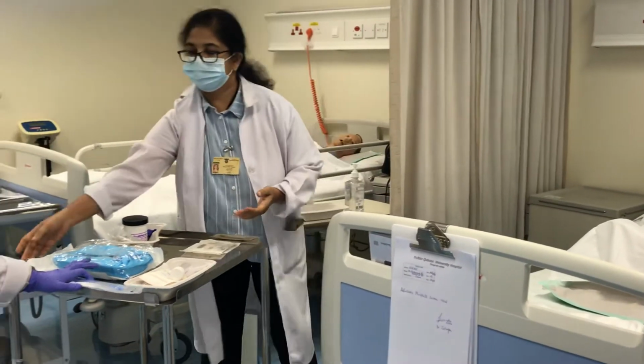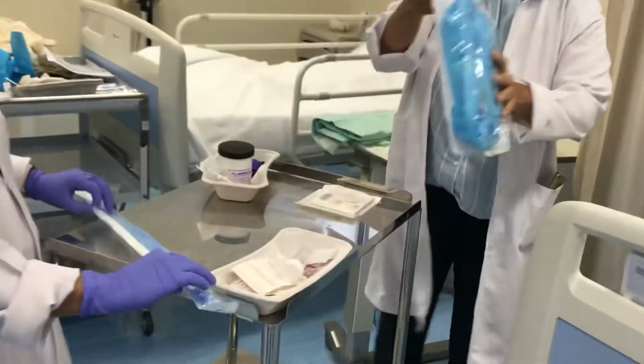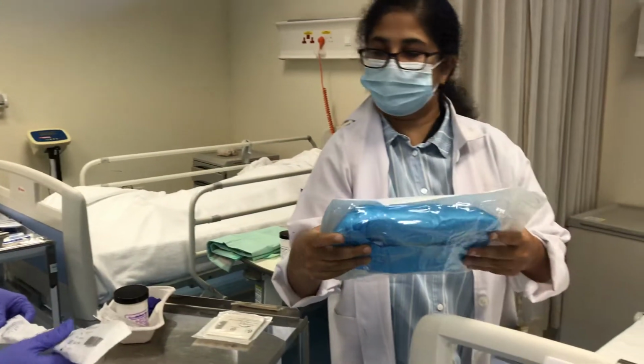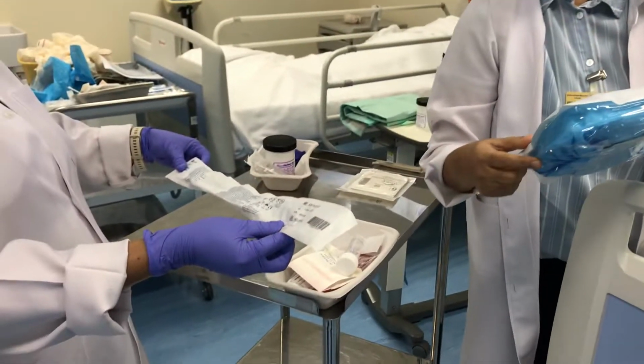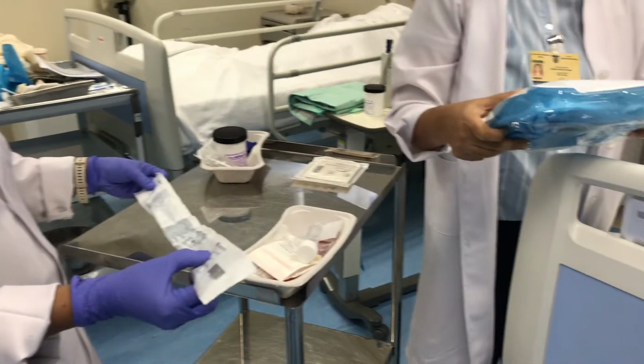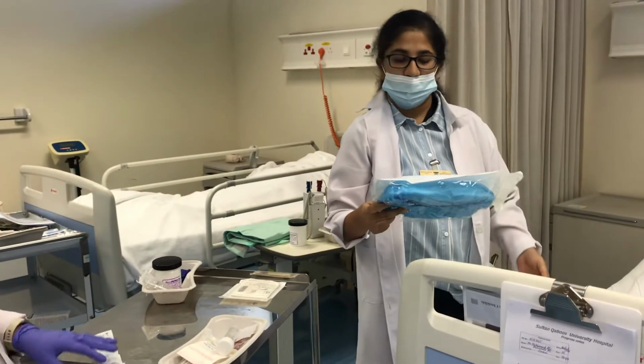So we have the catheter, then we have a sterile catheterization pack. The size also is there. I forgot to tell about the size. Again, it is in French, like the NG tube, no? We have it in French. CH also they say. Expansion, I forgot. I'll tell you.